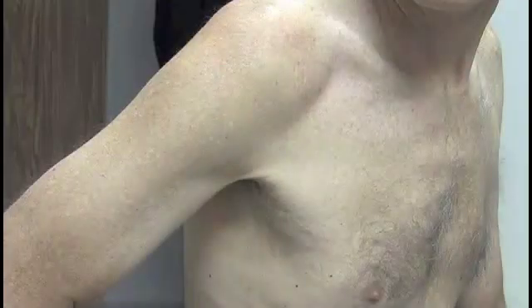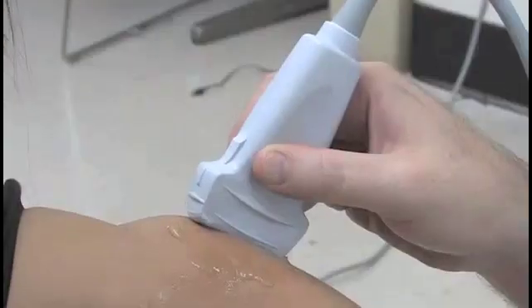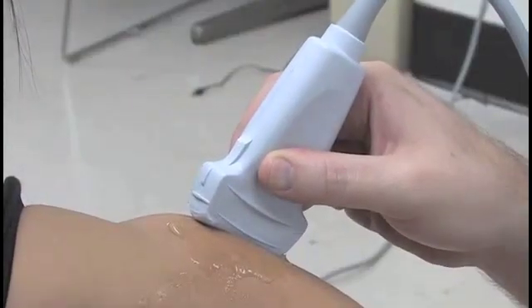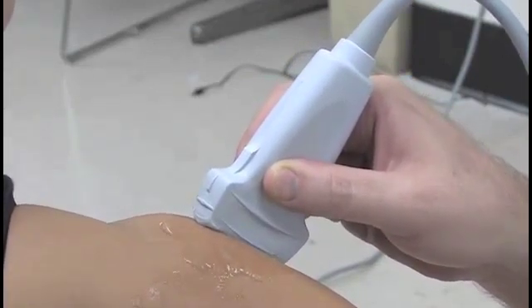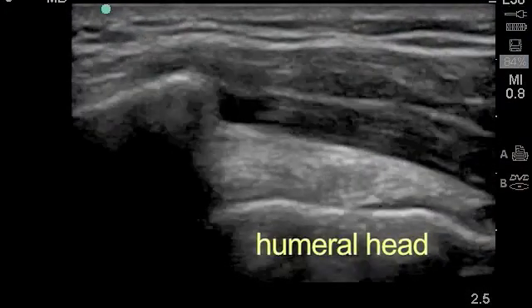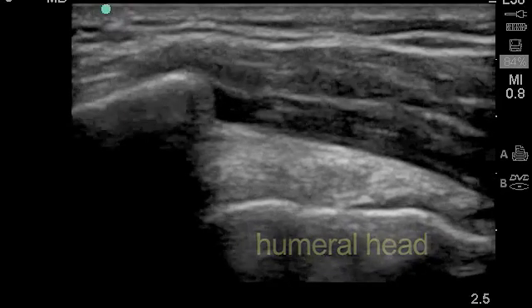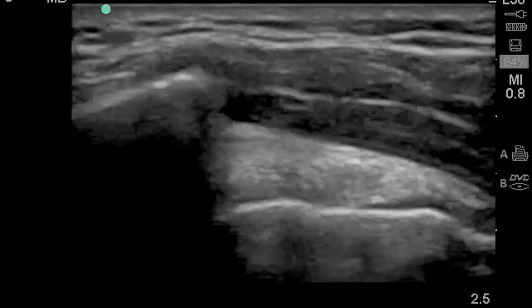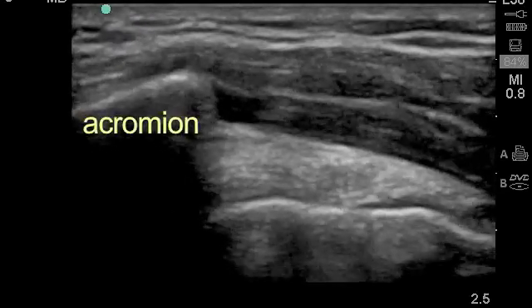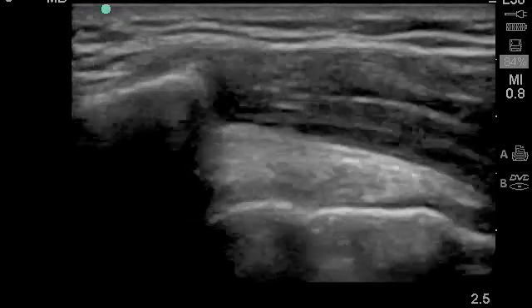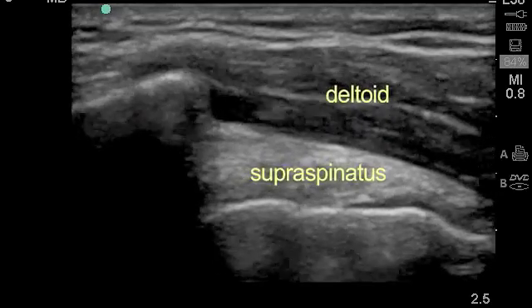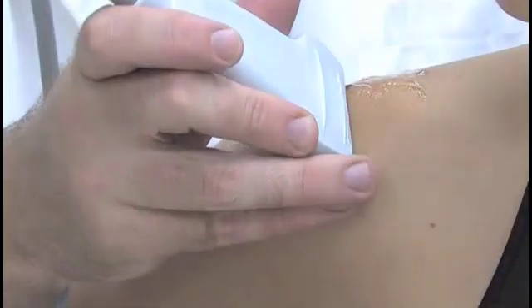The patient should be seated in an upright position with the ipsilateral arm positioned behind the back with the elbow bent. Place the transducer in a longitudinal position along the superior lateral aspect of the affected shoulder with the directional indicator pointing towards the patient's head. The cortex of the humeral head can be seen in the far field as a bright echogenic line. Superior to that, on the left side of the ultrasound screen, the cortex of the acromion can be identified. Superficial to the humeral head lies the supraspinatus tendon, and more superficially, the deltoid muscle.